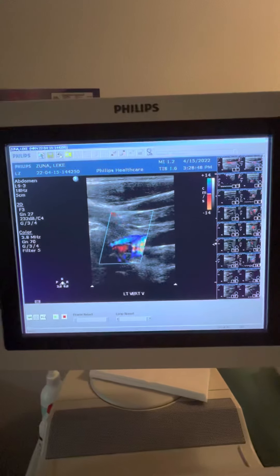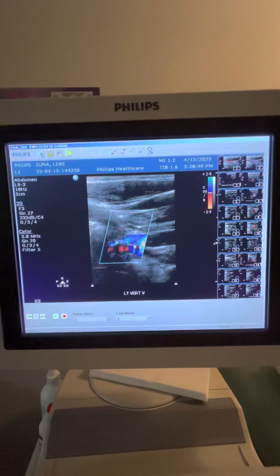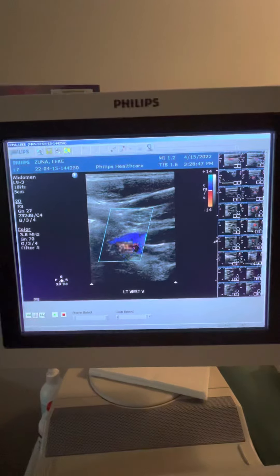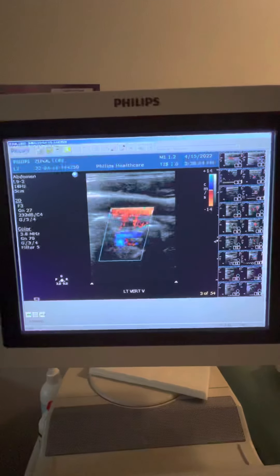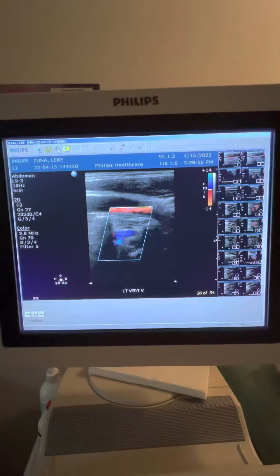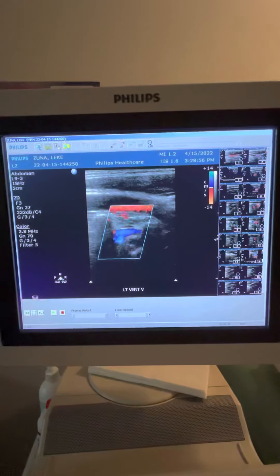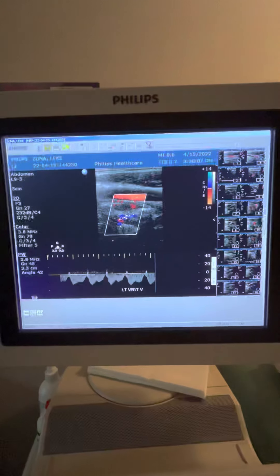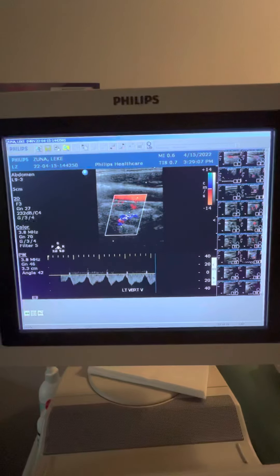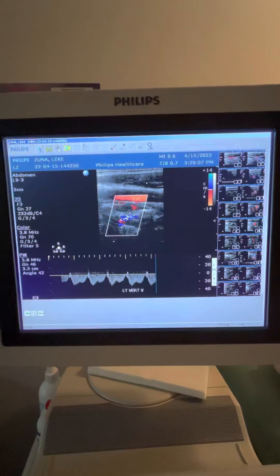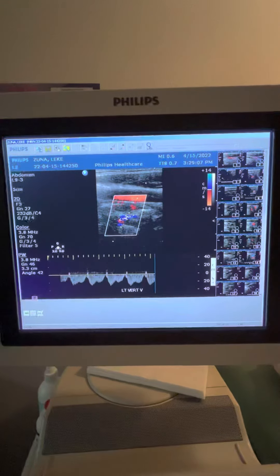Vertebral vein proximal, left. Vertebral vein mid, left. Doppler vertebral vein, mid, left.